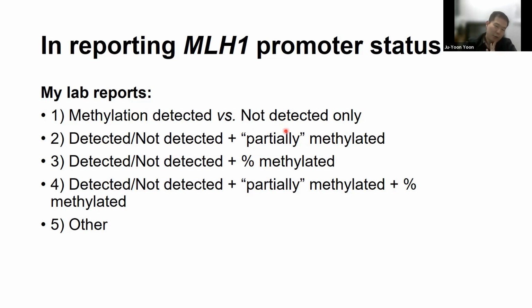One of the things that surprised me, to be honest, when I was reading the product insert for the Entrogen kit, is that they have this category where things can be reported out as partially methylated, and of course it's a quantitative assay, so I can report out the percent methylated. But if something is quote unquote partially methylated, I'm not aware of any clinical significance to that.